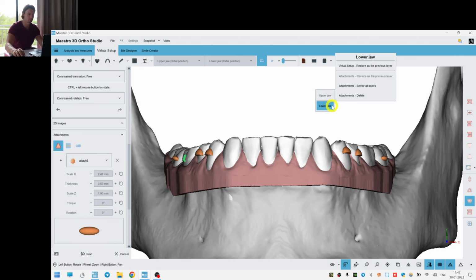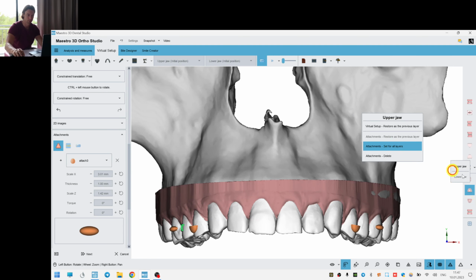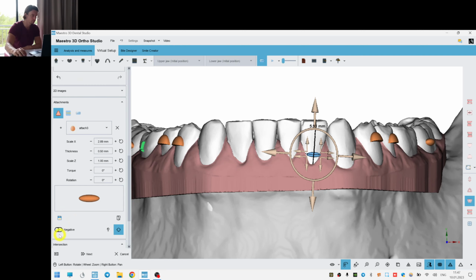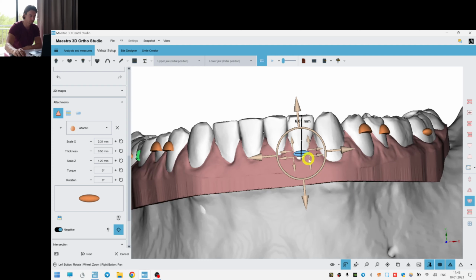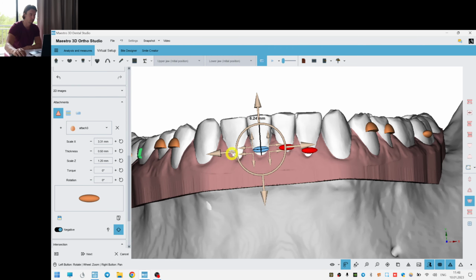So let's first set the attachments for all the layers and add some attachments to the last layer. Don't forget to make them look red. That means that they look inwards. It's called negative attachments here in Maestro.